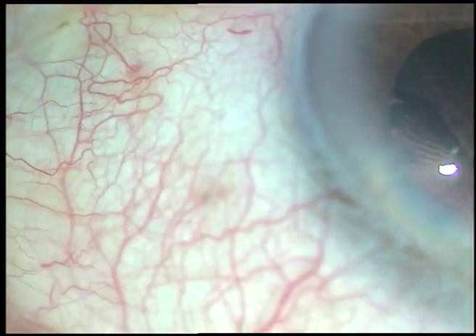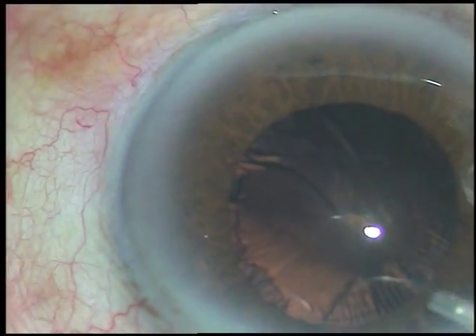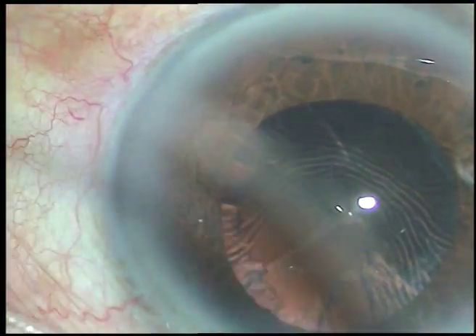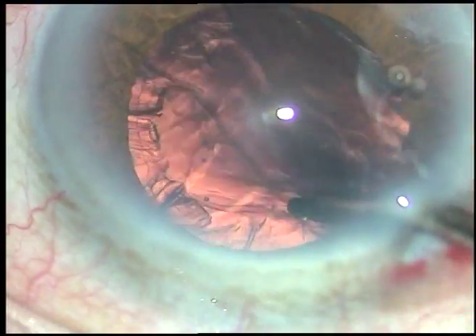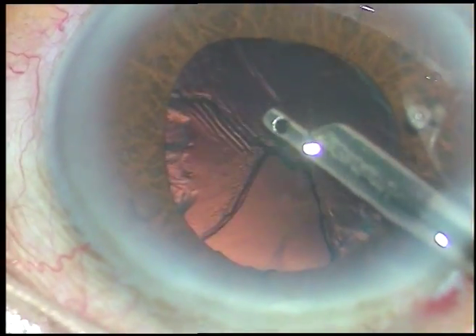In this case, we have made only one side port, so we have to use either coaxial IA or a Simcoe cannula. I am using a 23 gauge Simcoe cannula attached to a 10 cc glass syringe, and this works well. I have injected viscoelastic substance.